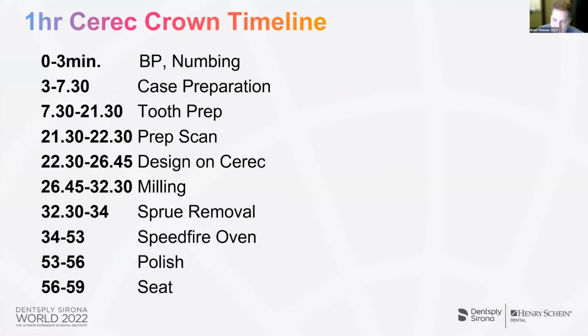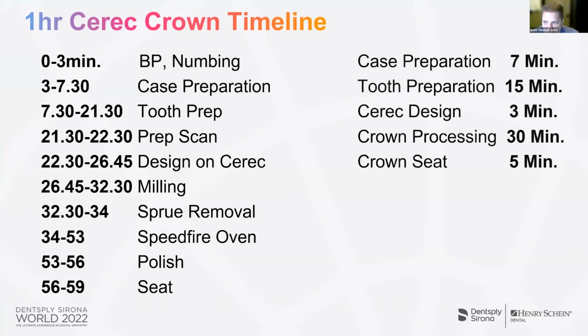So I timed it. In fact, after it was all said and done, I went back to my video and I even broke it down in the timings. For your case preparation, so the time they sit in your chair until you're drilling on their tooth, I've had about 7 minutes. You've got to wait for them to numb, blood pressure, all of that. That's a very crucial time that you can use wisely in preparing, whether you're getting the shade, putting the block in, or getting scans of the patient's mouth. There's a lot of things you can do in that 7 minutes while they're numbing to further that process along.